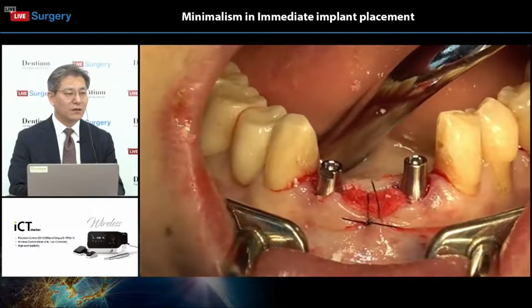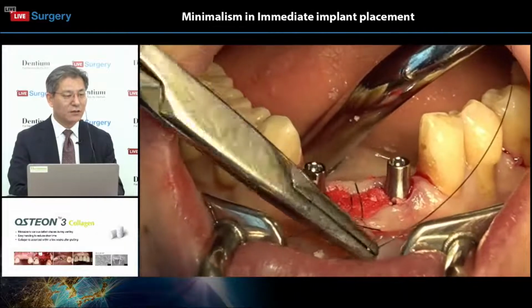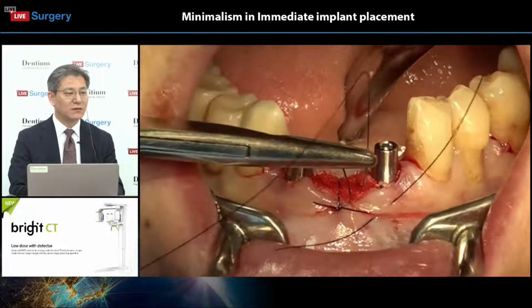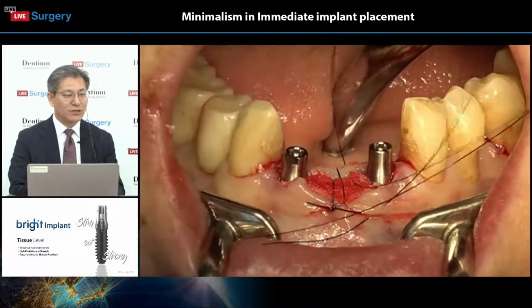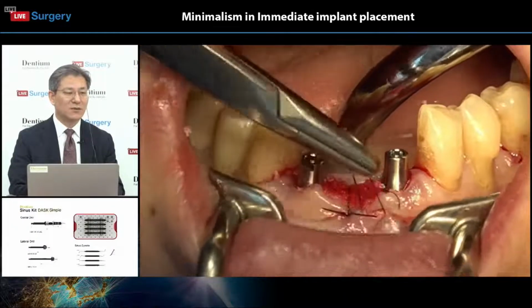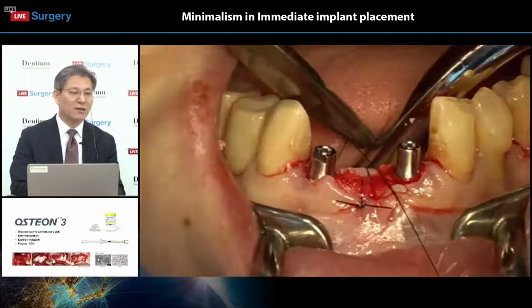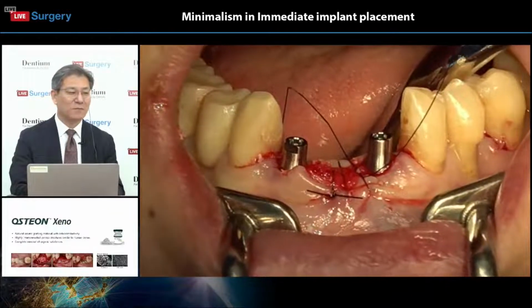Okay, he has another suture knot around this number 32 implant fixture area. Nowadays, Dr. Chung tries to suture with a modified horizontal mattress, a little bit modified style. This time the labial will look like a modified horizontal suture, but the lingual part is just an interrupted suture. So it is a little bit tricky.